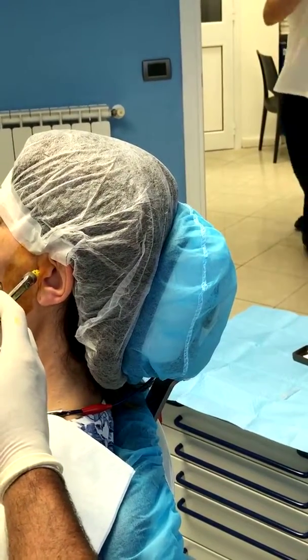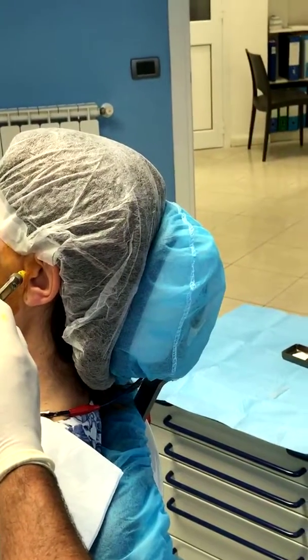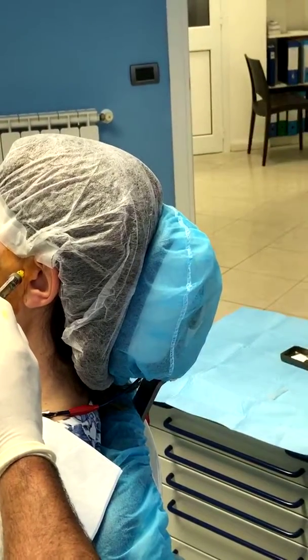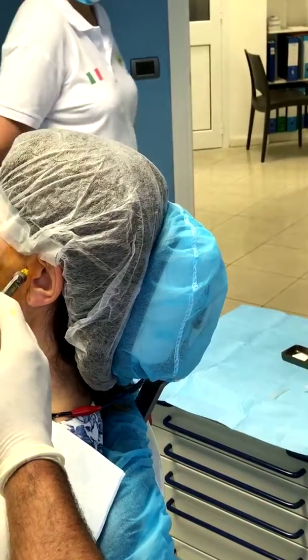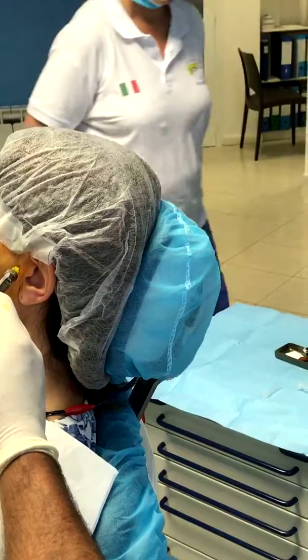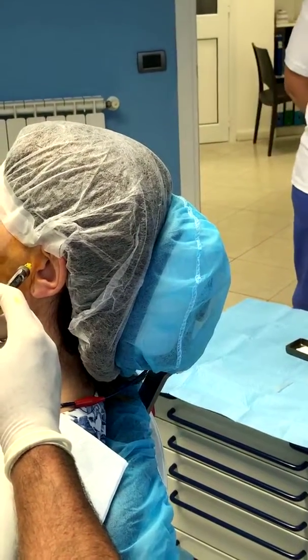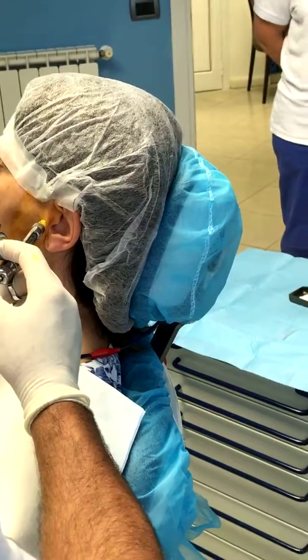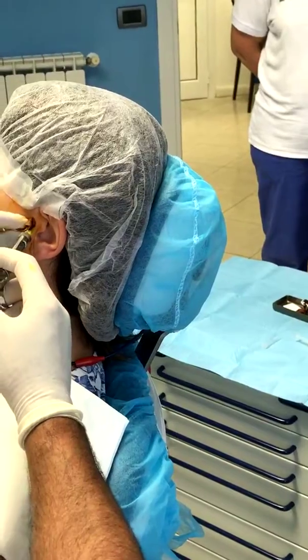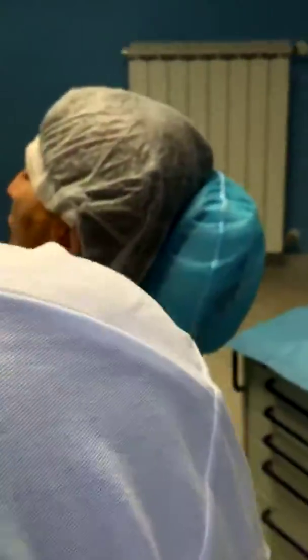At this point you have done two things, as I said before. You have turned a virtual space into a real space, so you have got a distension of the temporomandibular joint, plus you have got an anesthesia of the joint. Usually I do always half of a vial, but in this case I prefer to be safe. It's not going to cause pain.